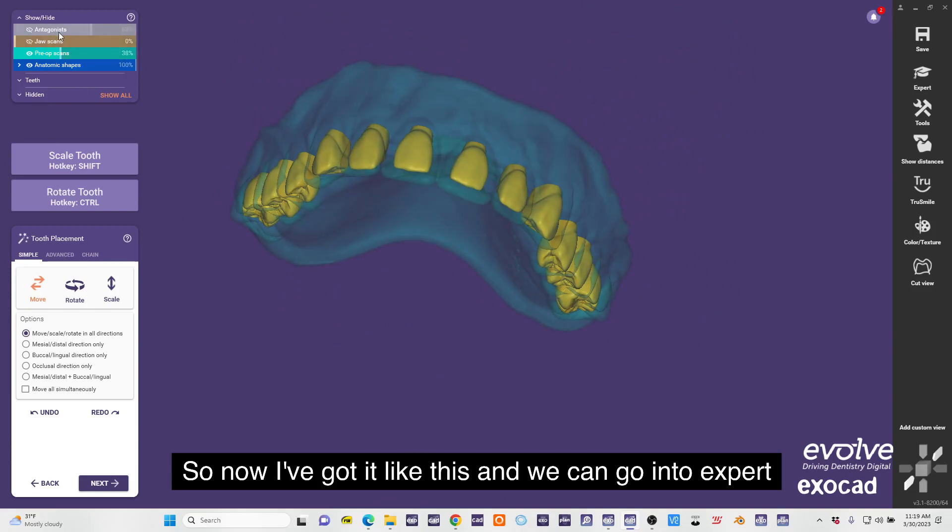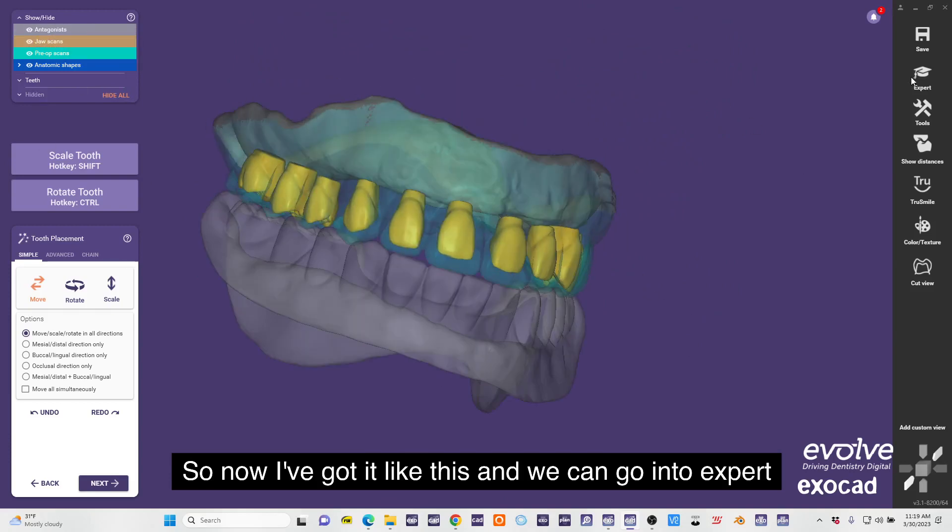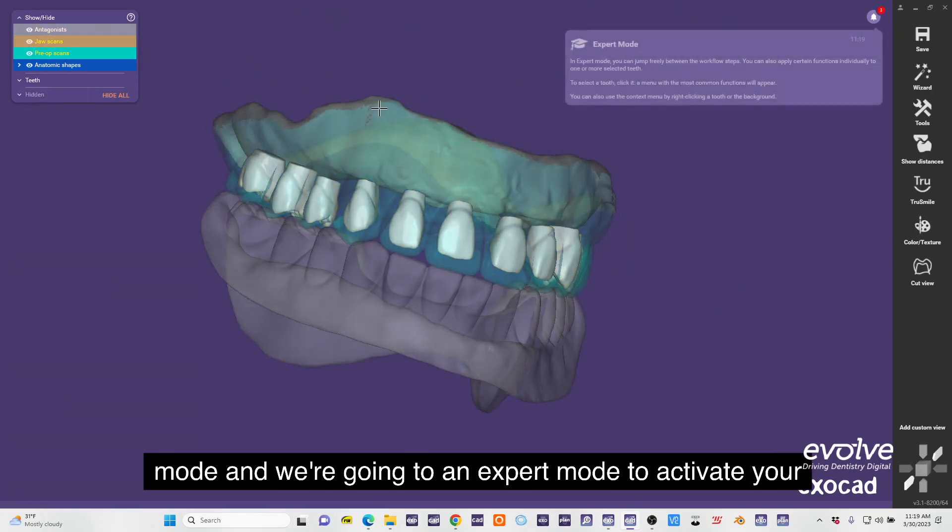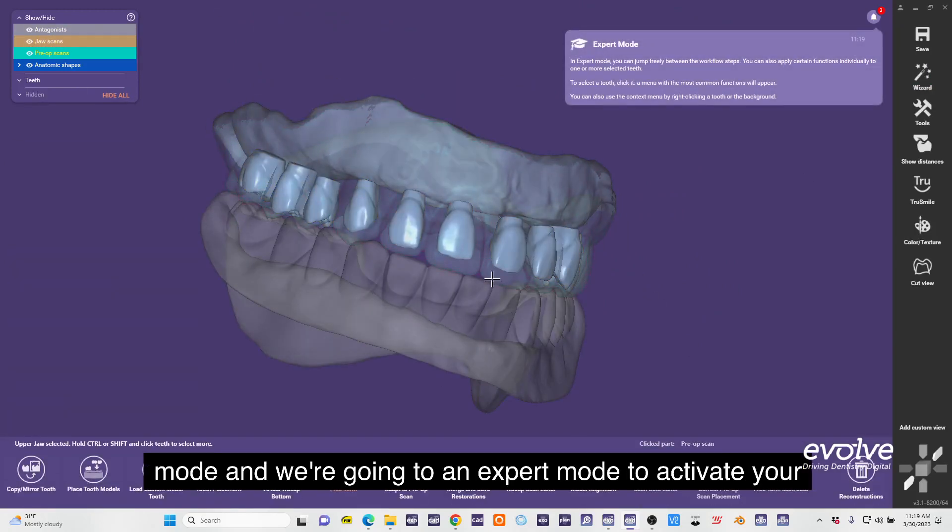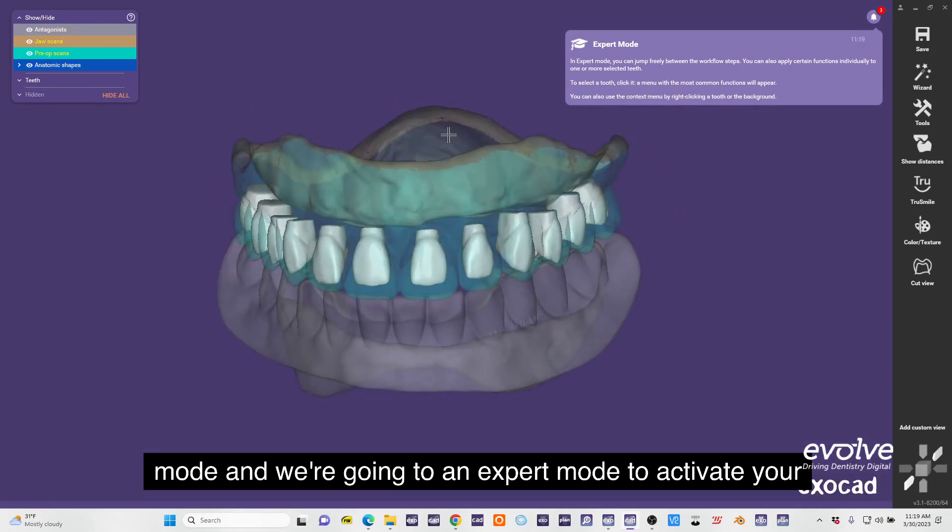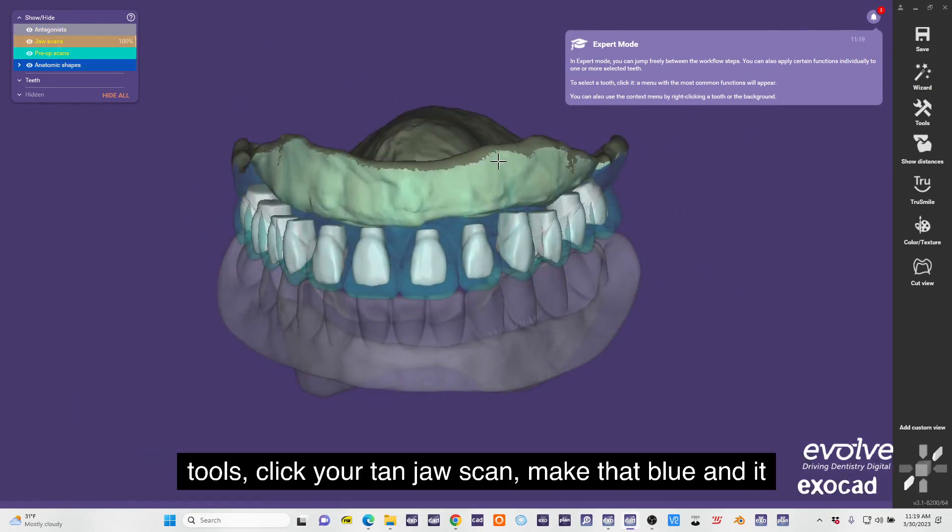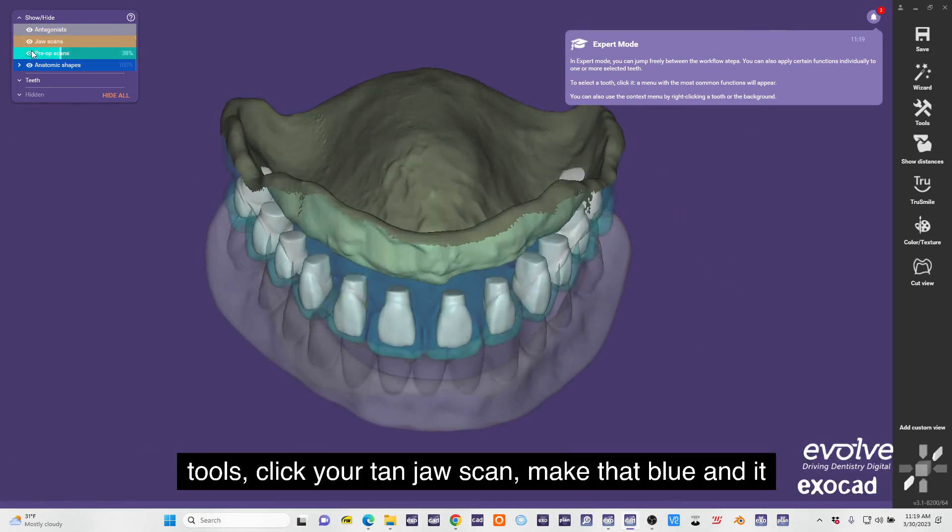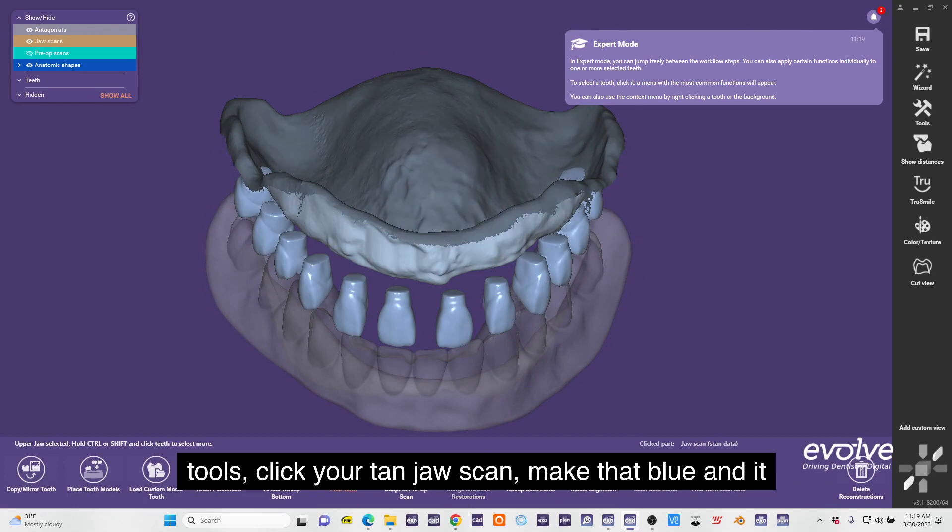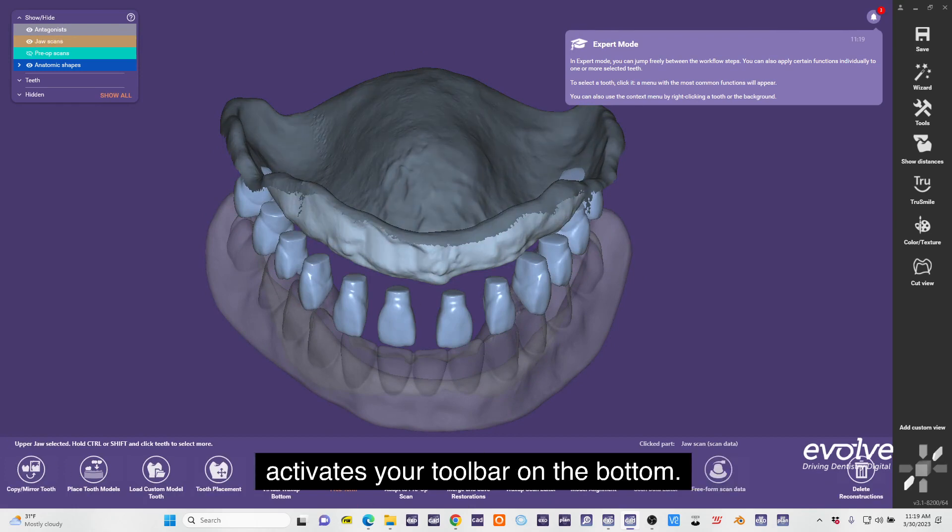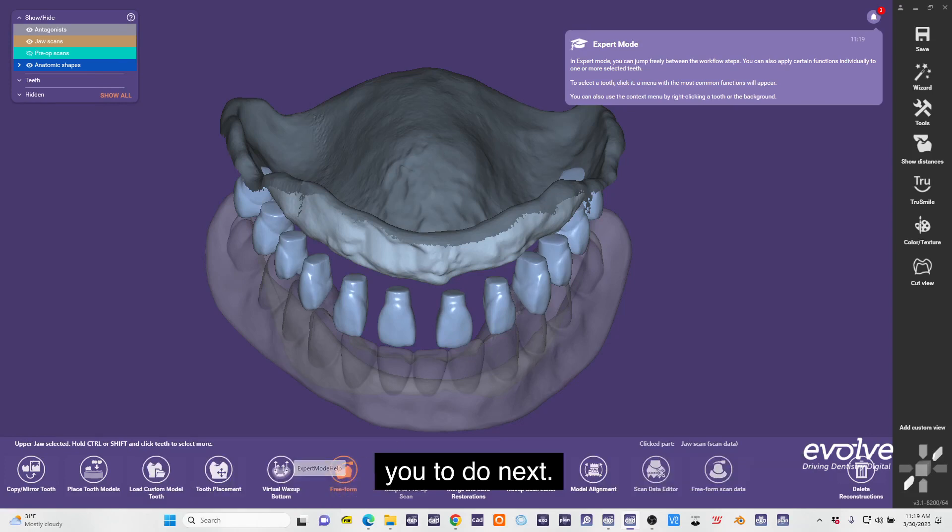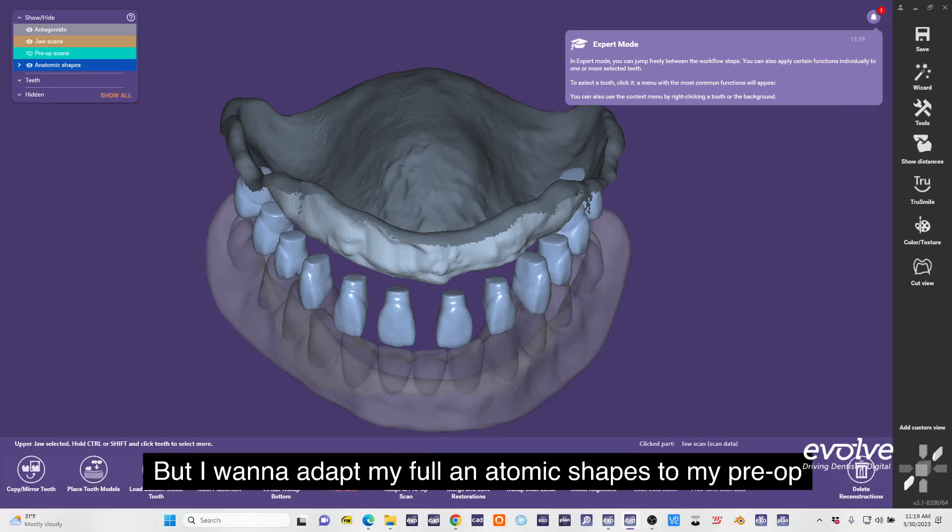Now I've got it like this and we can go into expert mode. In expert mode to activate your tools, click your tan jaw scan, make that blue, and it activates your toolbar on the bottom. The wizard is highlighted in orange on what it would want you to do next, but I want to adapt my full anatomic shapes to my pre-op scan.